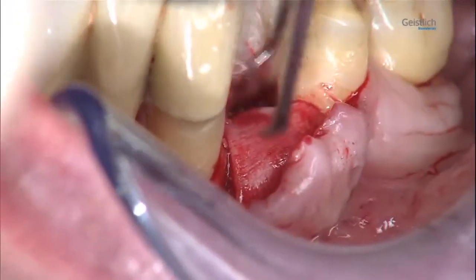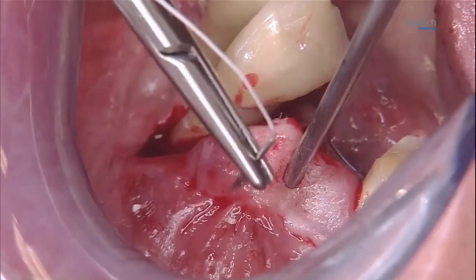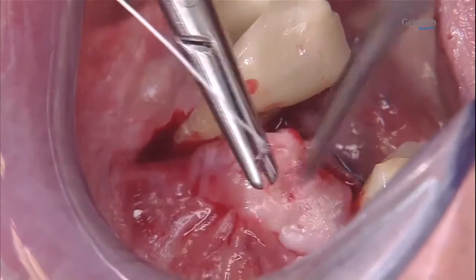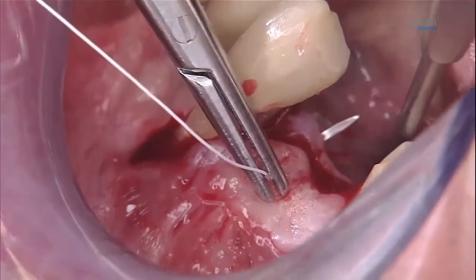The Geistlich Bio-Gide membrane is then laid over the Geistlich Bio-Oss Collagen. It covers the defect and is wetted with sterile saline. The tip of the membrane is pushed under the lingually mobilized flap.